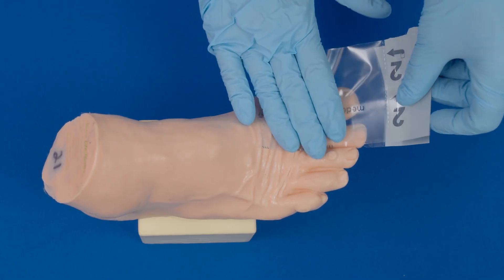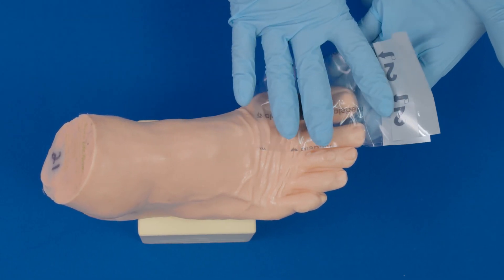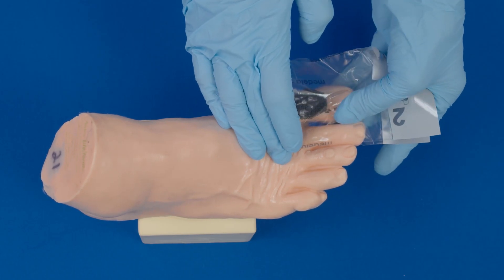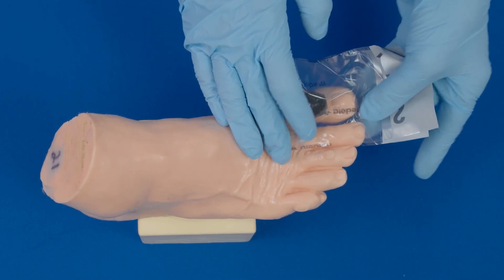Then apply another piece of transparent film on top to sandwich the wound and the toes next to the wound.